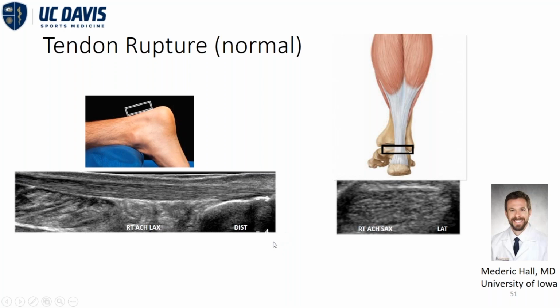However, depending on the bed and the patient, where your ultrasound machine is, just make sure that the image you're seeing matches up with how your patient is positioned. But if you have the luxury to do this, proximal will be screen left, distal will be screen right. What we see here is beautiful, normal, healthy Achilles tissue.